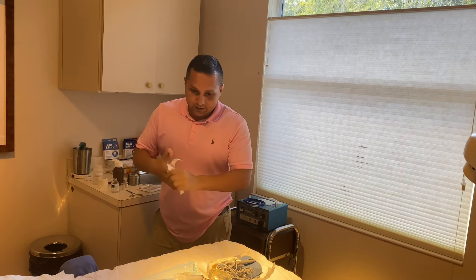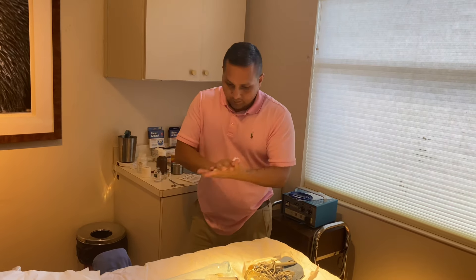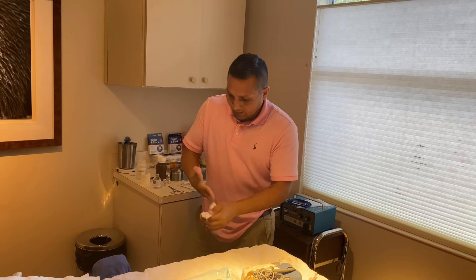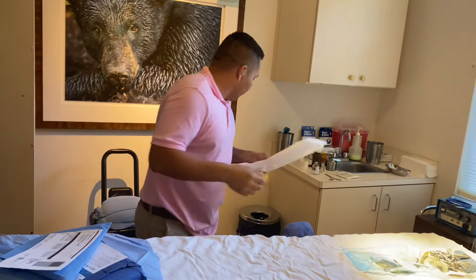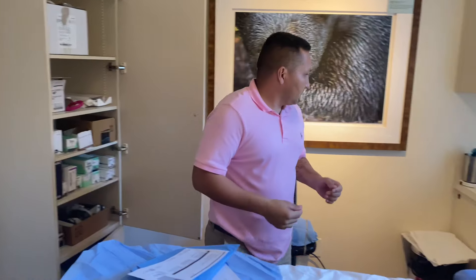If you're new to this, you may require help to pour the saline water or hold up the supplement. I have bigger hands than Dr. Stein and Dr. Carmichael, so I use size seven and a half gloves, which are right here.